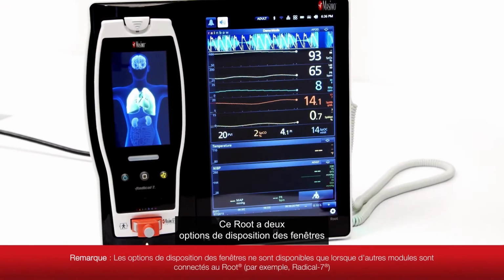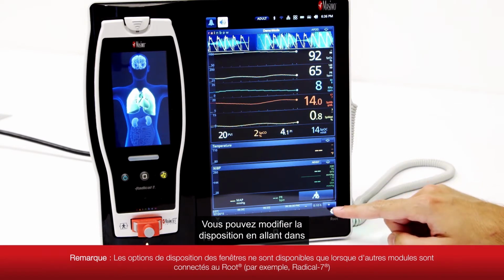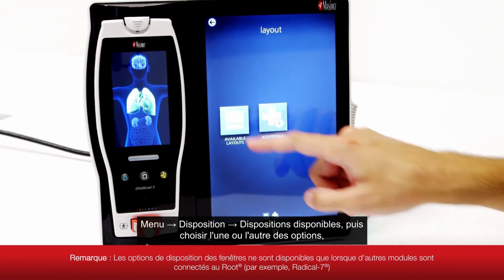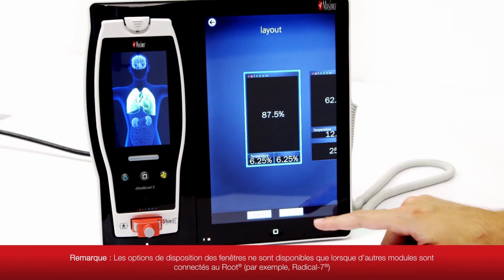This root unit has 2 window layout options for the non-invasive blood pressure and temperature windows. You can change the layout by going to Menu, Layout, Available Layouts, and then select either of the options. Touch OK.